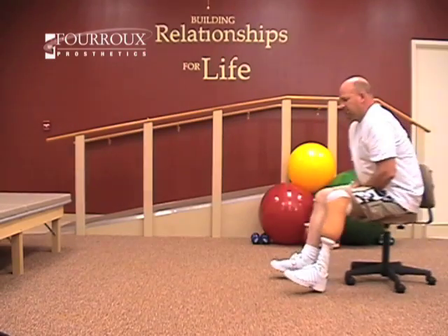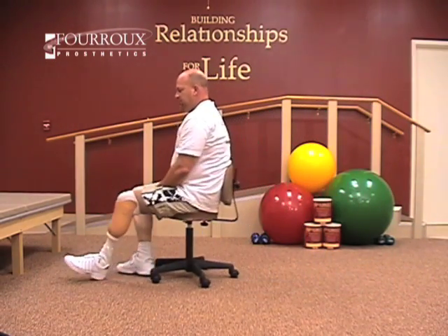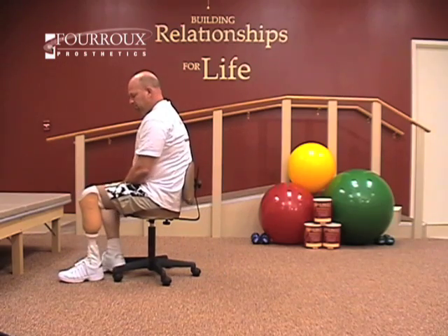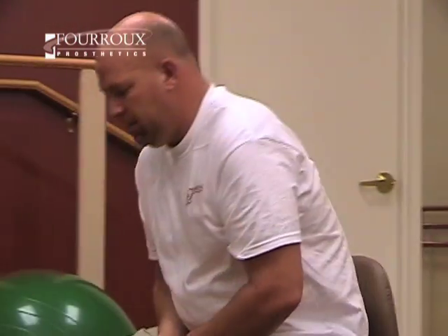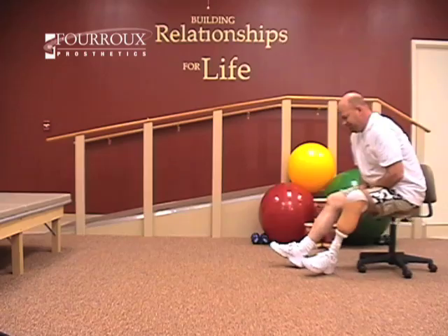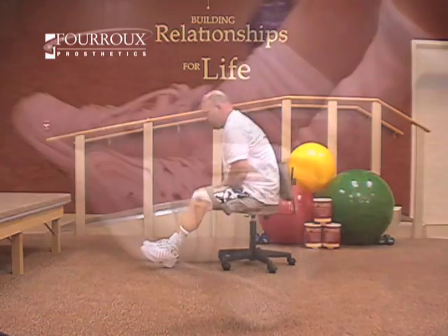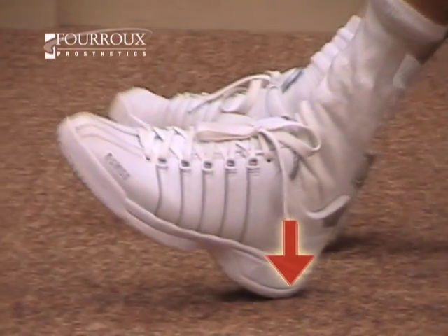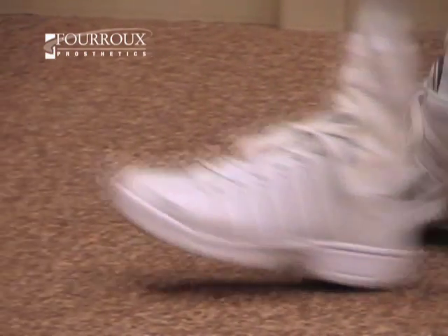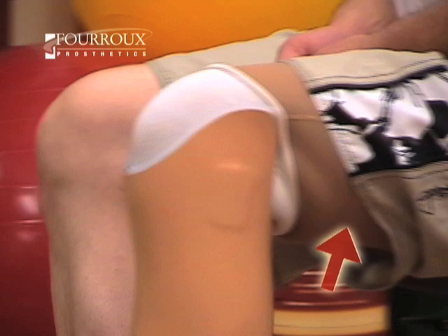For the stool scoot, you'll need to find a rolling chair and a large area of open, flat, and hard flooring. Push yourself backward across the floor, then pull yourself forward to your starting position. You'll find pulling forward more difficult, so it's important to dig in with your heel. Contracting your hamstrings, the muscles on the back of your leg, is what allows you to pull.